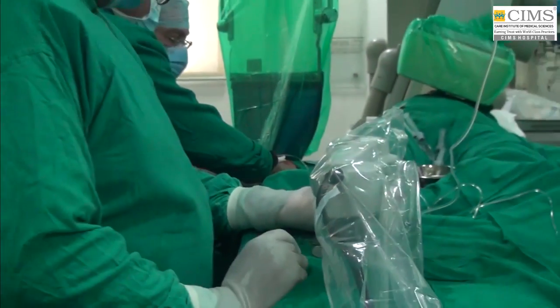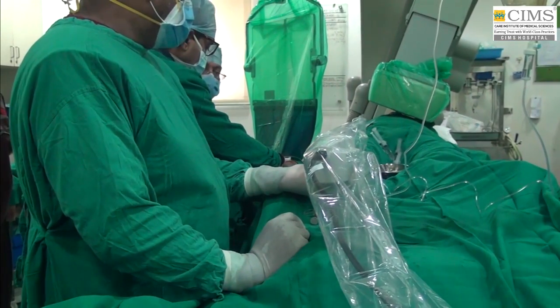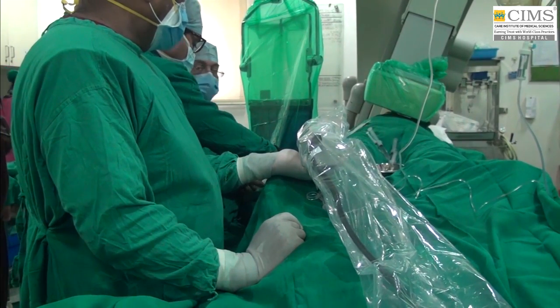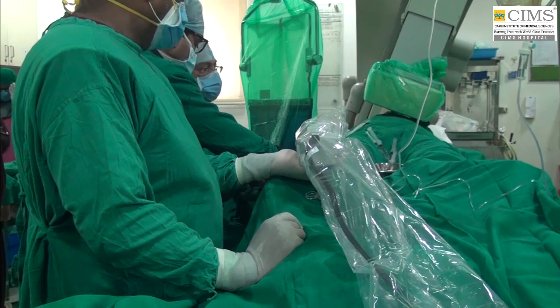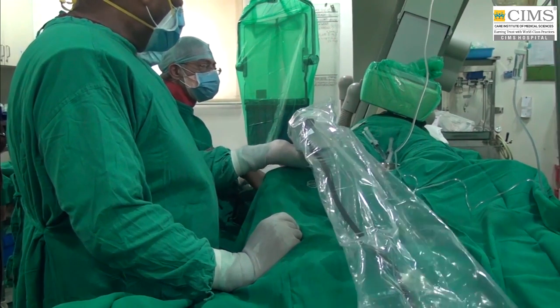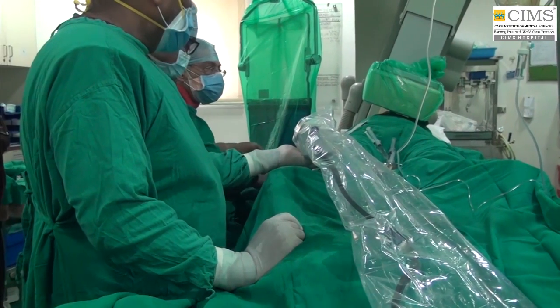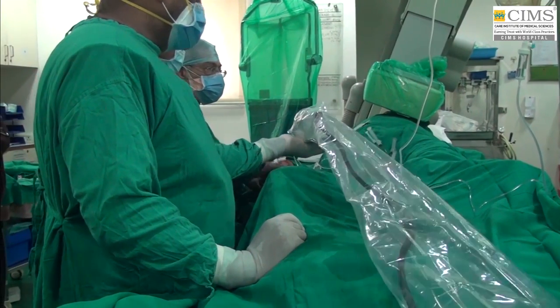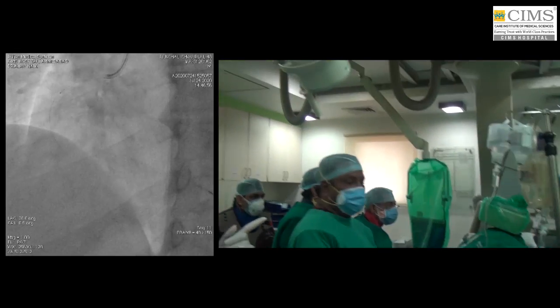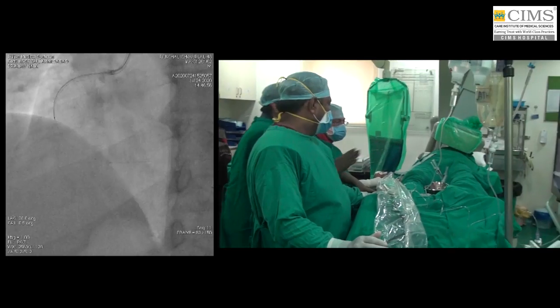We use OCT more frequently for two reasons. One is the ease of measurement, and the crystal clear imaging capabilities of OCT is so good that IVUS cannot compete with that. And second, in some of these very long lesions with variable sizing, the speed with which OCT and the software within the OCT system gives me a lot of information is much faster than IVUS.